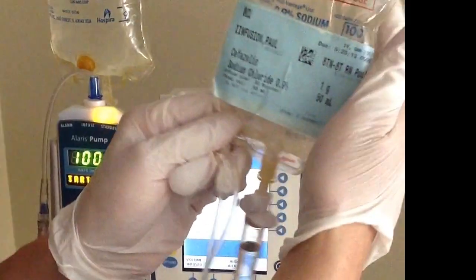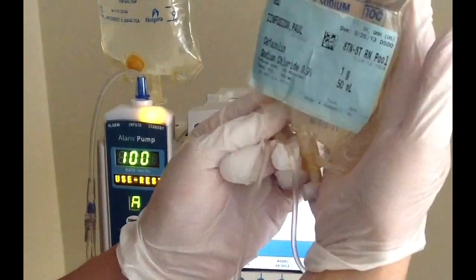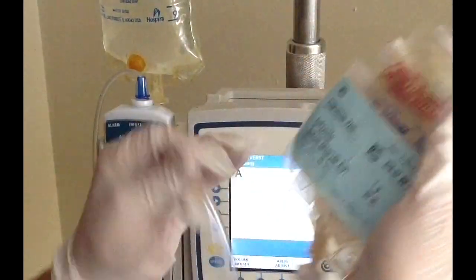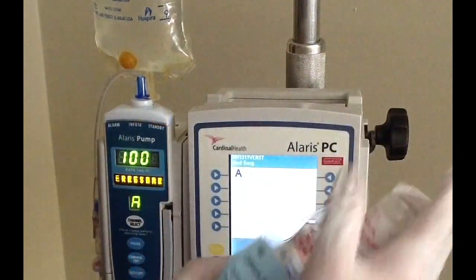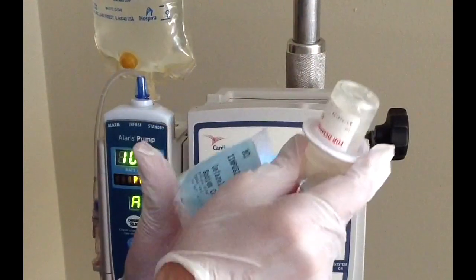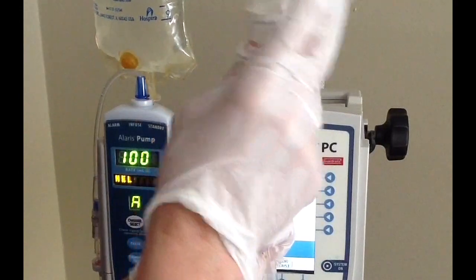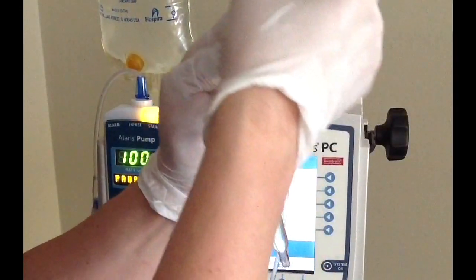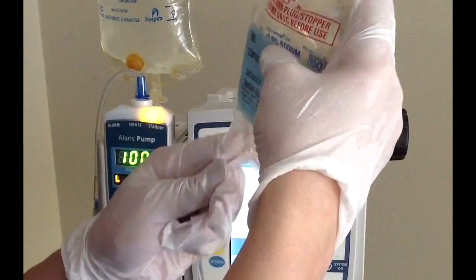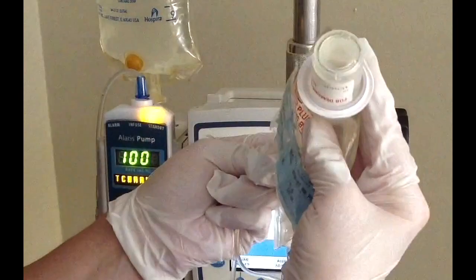The example that we have here today is a cefazolin, which is an admixture, so it has powder in the top of that bag that you're going to have to mix. To mix it, you're going to have to scrunch down your bag and then grab the little plug that's inside and pull it out. Now that the plug is floating in the water, you can mix the water with the powder until it becomes clear. You can take a look at the top of that container where the powder was to make sure that it's cleared out.